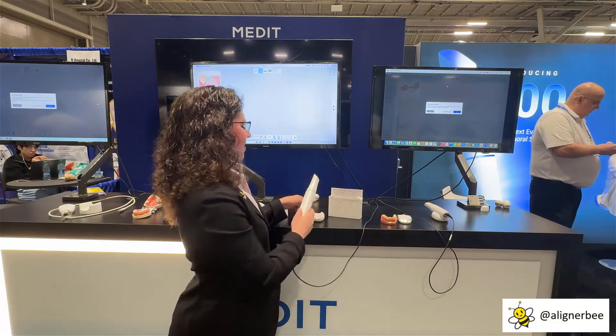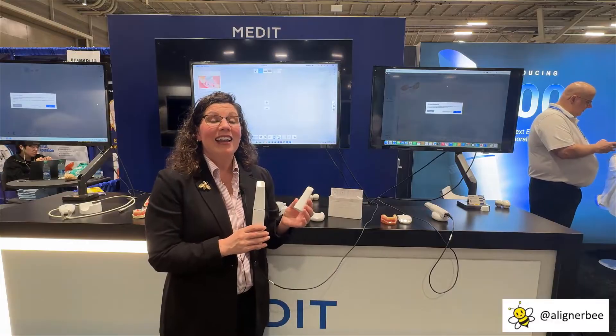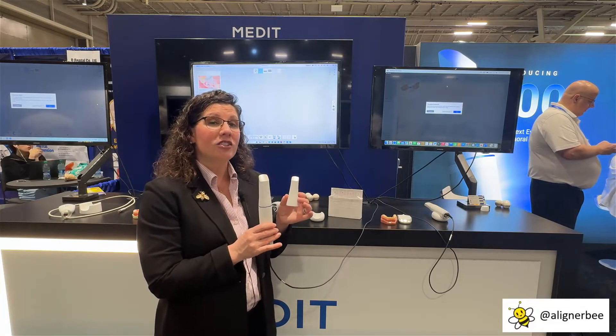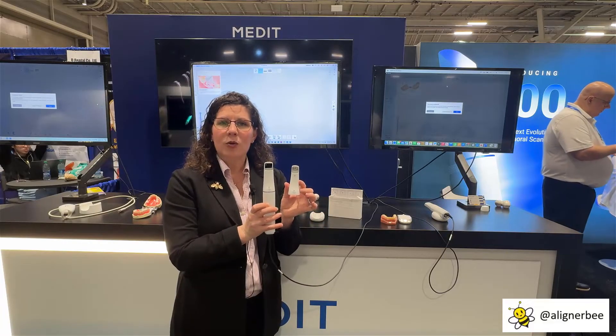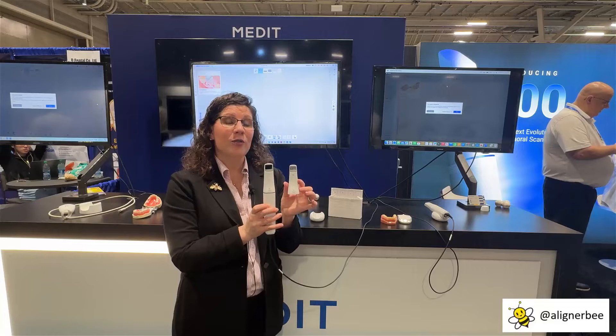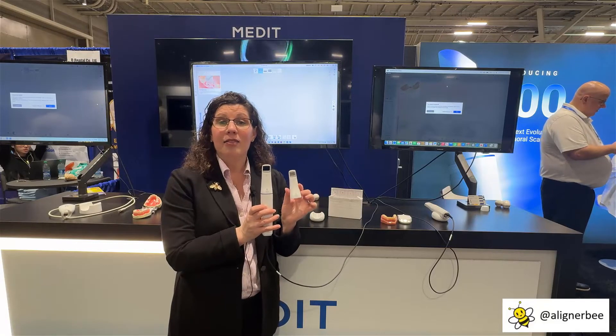Let's go ahead and take a look at the tip size. The Medit i900 has three different tip sizes: small, medium, and large. Today I have the medium and the large available for us to take a look at. We can see some of the versatility this is going to give us when scanning patients of all ages and limited mouth opening. There is a difference in the field of view size — the larger tip is going to scan faster with the larger field of view versus the medium and the small tip.